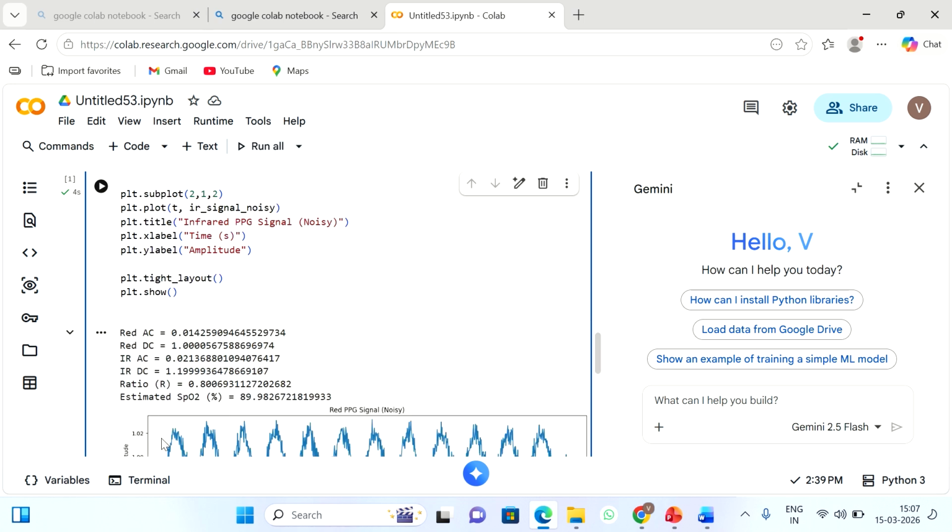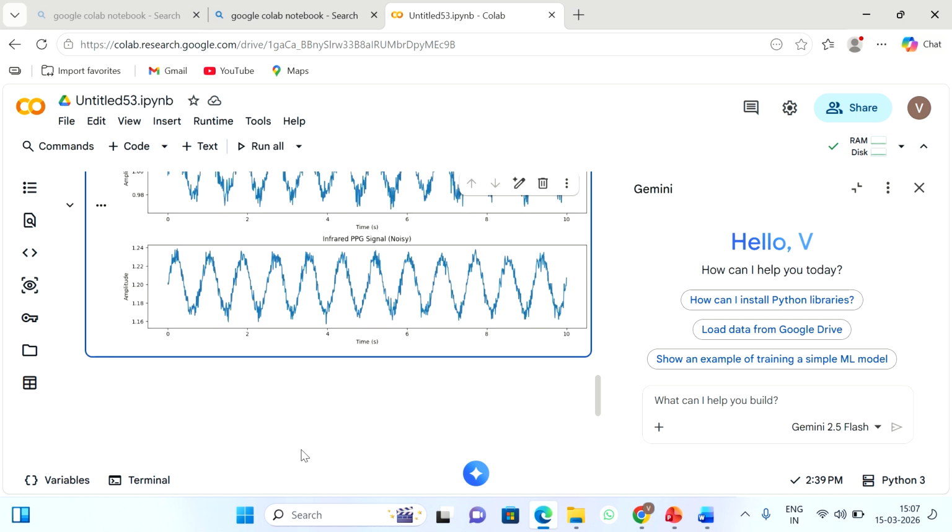This is the meaning of plt.show. See, all the graphs are visualized. So all values are calculated and then it is seen.